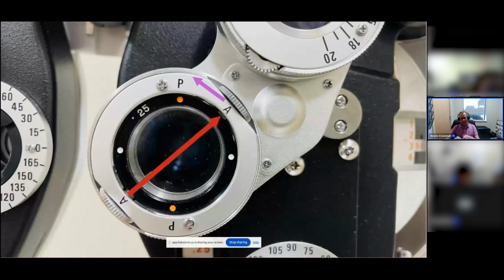So here you can see that the line, the red arrow between the A's, is lined up at the 40 degree meridian. And if I flip that again, then that orange dot will be on the other side. So now looking at that purple arrow, the orange dot is on the left. If I flip it again, it'll be on the right.